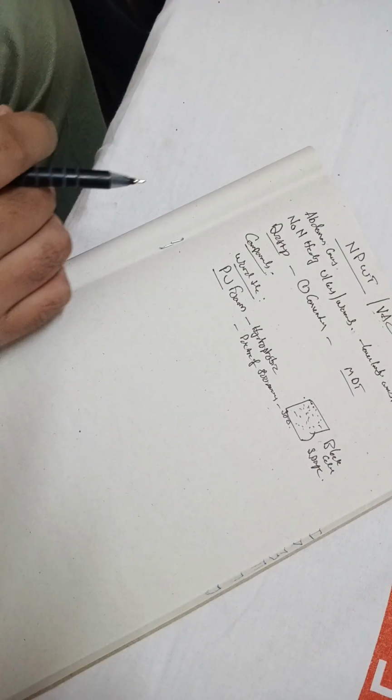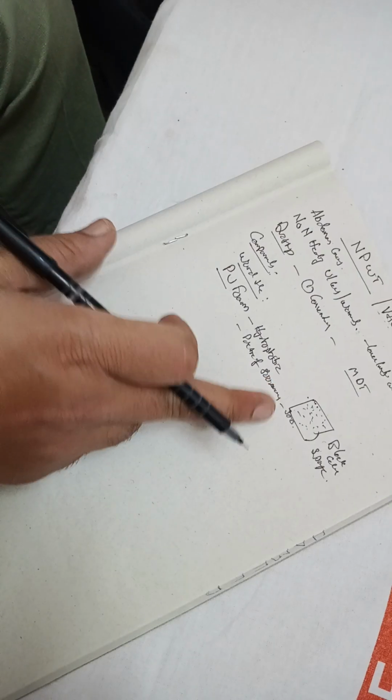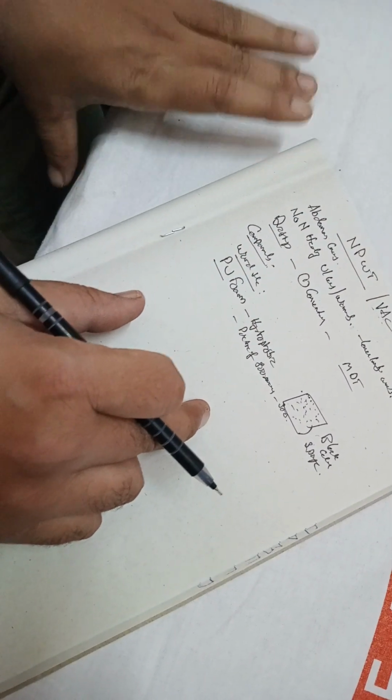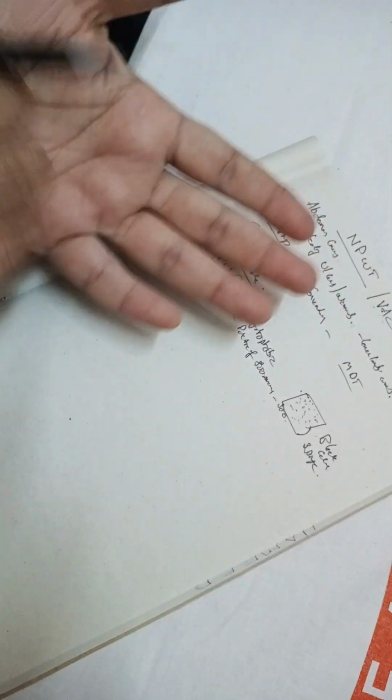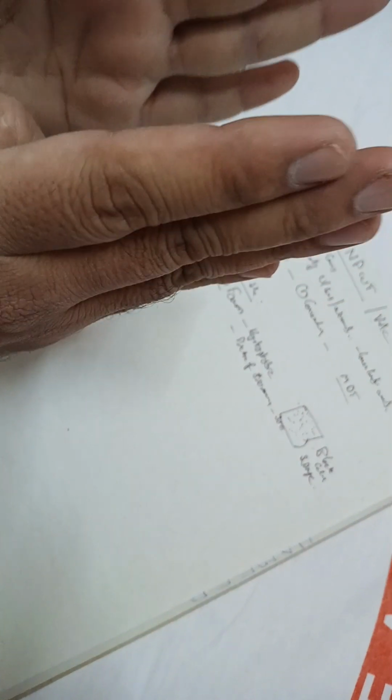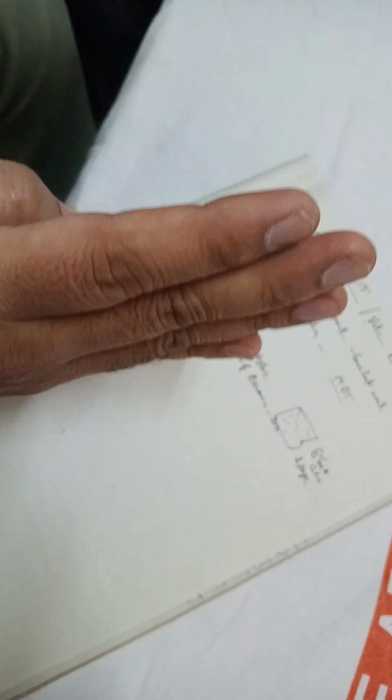It is PU foam. So for your understanding, if you have not seen this medically, non-medical uses are, your mattress is there, in that also they use PU foam. And there is a scrubber at home in the kitchen that your mom or your maid will be using. That scrubber has one green and one yellow part. Have you seen that anytime? So that yellow part is also PU foam.